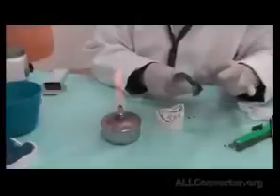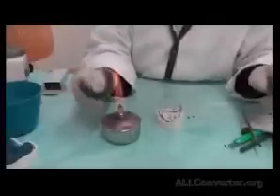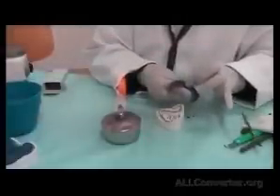We brought the utility wax and began pressing it into location. So as if I'm doing it with utility wax. Anything on the fitting surface I remove. More hand shaping, finger shaping of the border, make it more uniform.